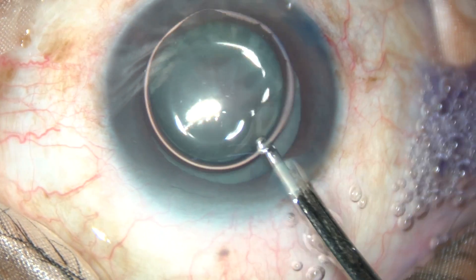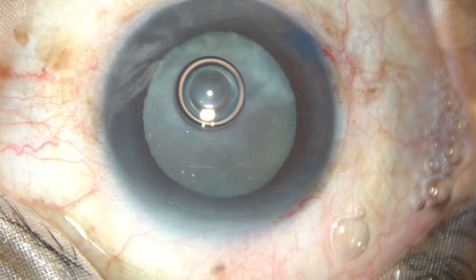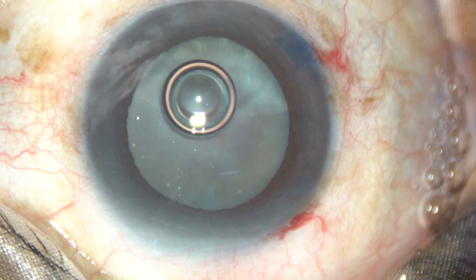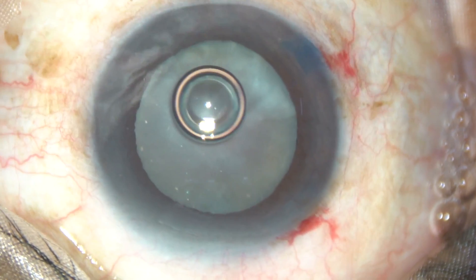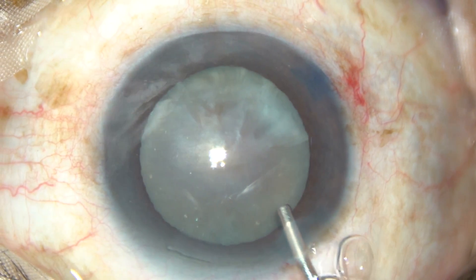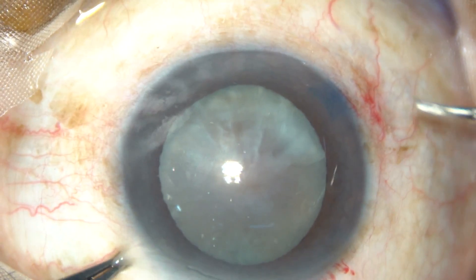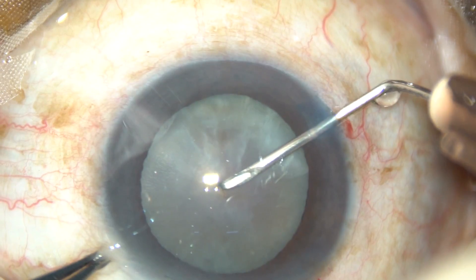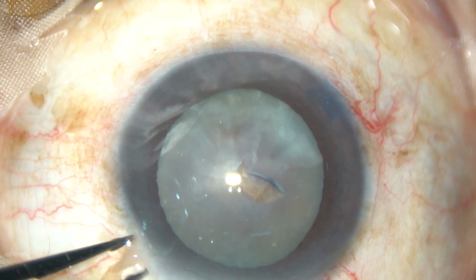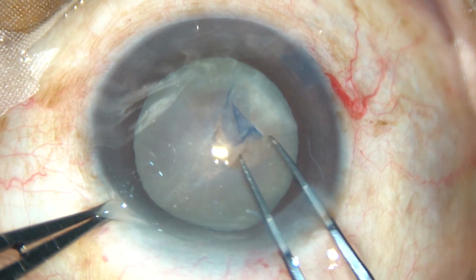The dye is now washed out. The pupil is tending to become small at this moment. From the very beginning I was afraid that the pupil would become small during surgery, so I have kept a pupil expansion device ready for application. Capsulorhexis is being done. At this moment I am very careful to watch if the zonule is weak or not — it is not. The zonule is okay.